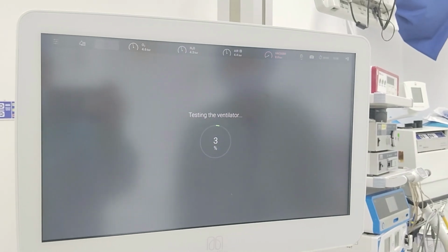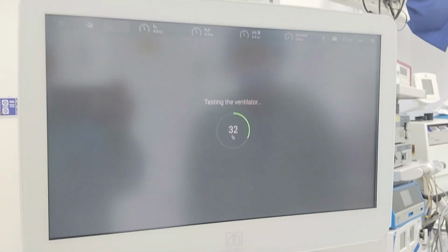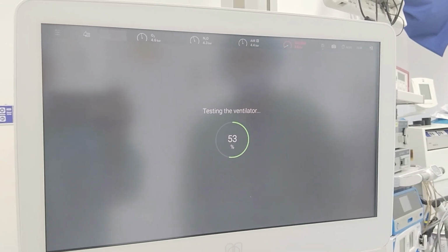Good day guys. Now in this video we are going to repair an anesthesia machine.